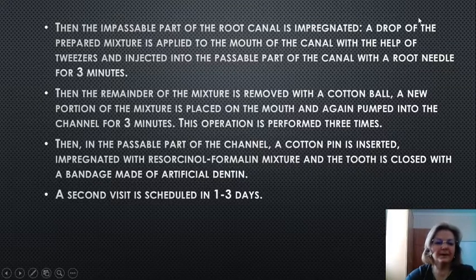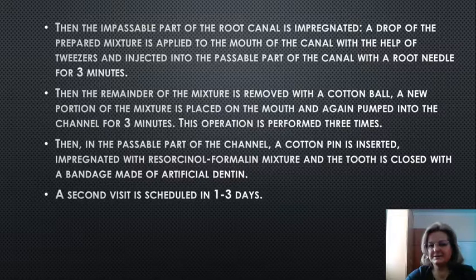After that, the remainder of the mixture is removed with a cotton ball, and a new portion of the mixture is placed on the mouth and again pumped into the canal for 3 minutes.